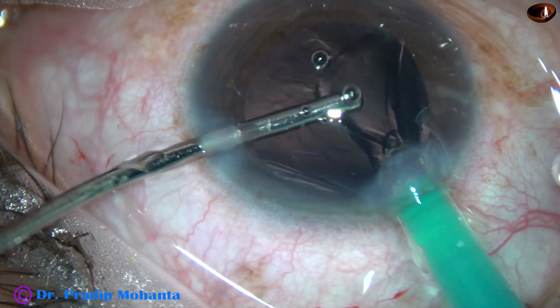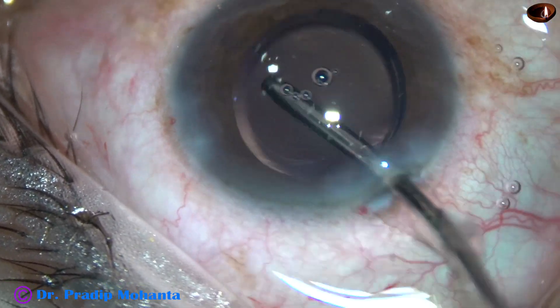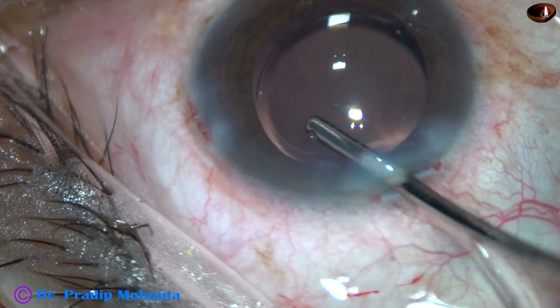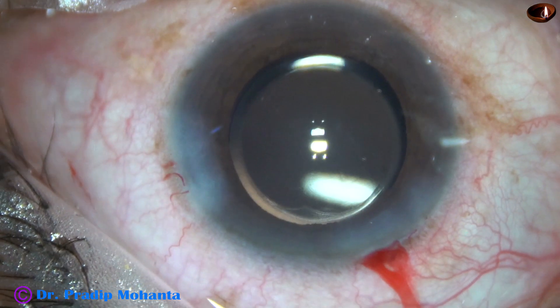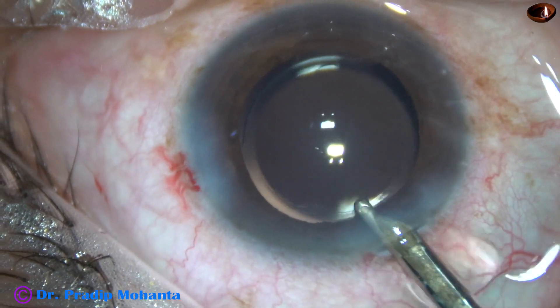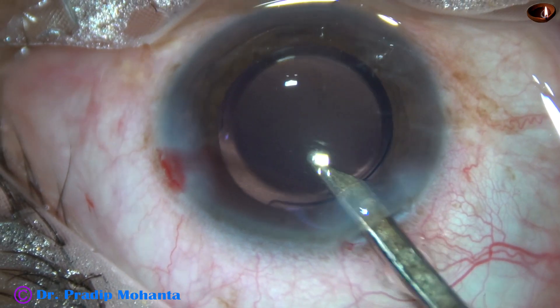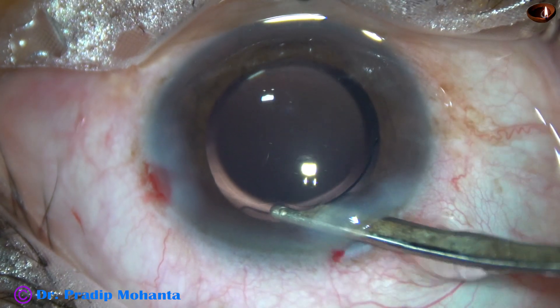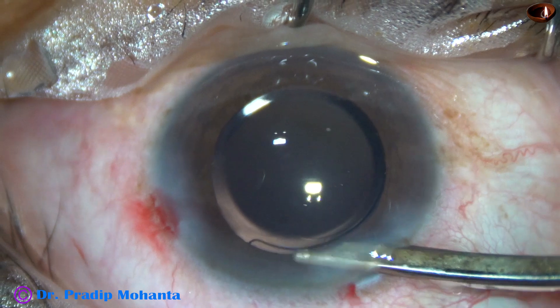The leading haptic goes into the capsular bag, and just by a tap of the left-hand instrument, the trailing haptic also goes into the capsular bag. We have not used viscoelastic in this case for implantation, so the anterior chamber is clear. The side port is closed by hydrating corneal stroma on either side of the paracentesis wound. This is the final lavage of the anterior chamber — the chamber and bag are cleaned nicely. The intraocular pressure is kept on the higher side of normal, and then the case is concluded.